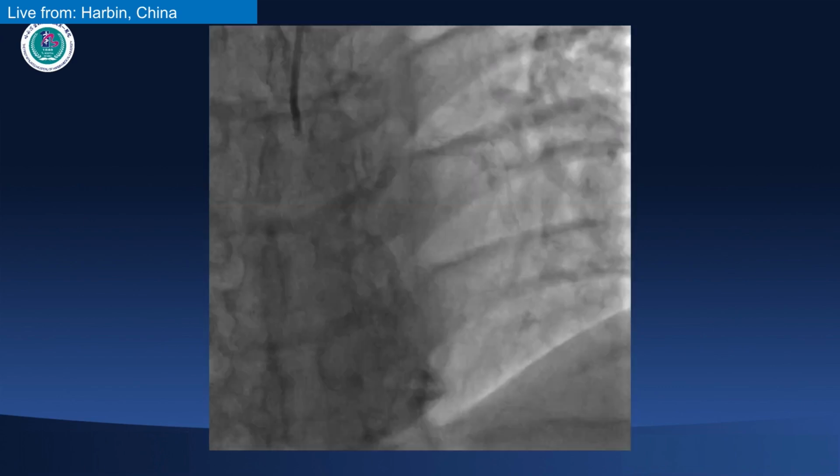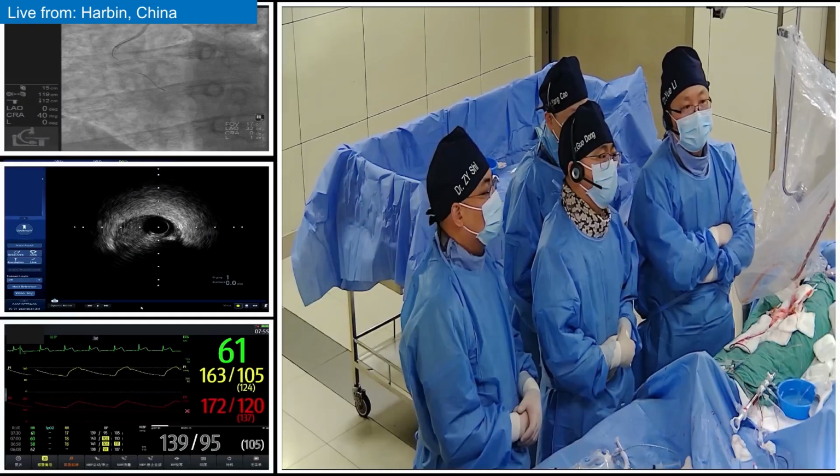Next. Next. Move, please. Okay. Okay. Okay. Yes. Doesn't matter. Just introduce. Okay. Yes. Let me introduce the right coronary angiography, and this Next slide, please.